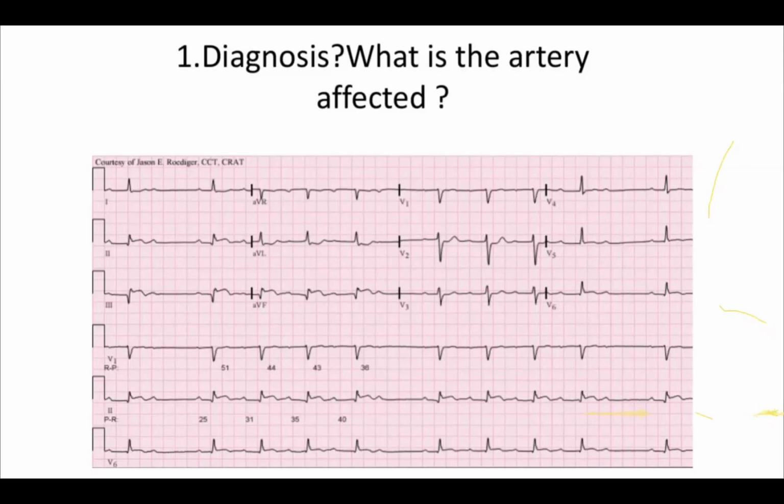So again, may I ask, if there's RV infarction and the patient presents with hypotension. Remember, in your OSCE it is not usually just an ECG picture. There will always be a clinical scenario, right? So if there's low blood pressure with possible RV infarction, what is the salient thing in the management? As a registrar, what should you do to improve the blood pressure? We can give fluids. Yeah, very good. So you can give fluids. In order to do what?